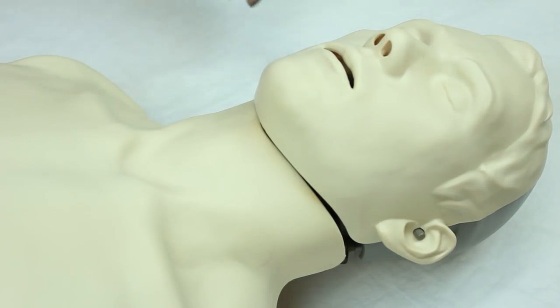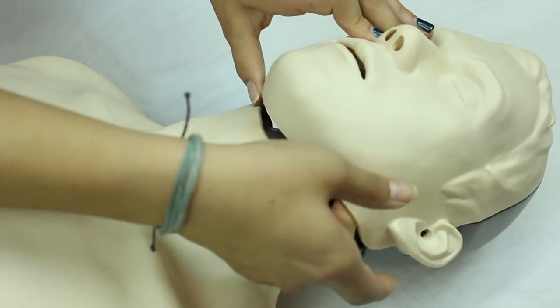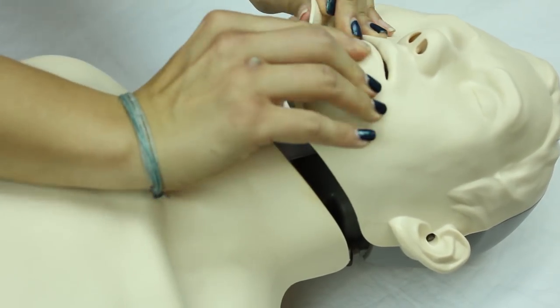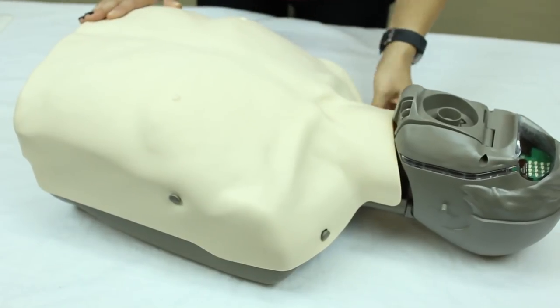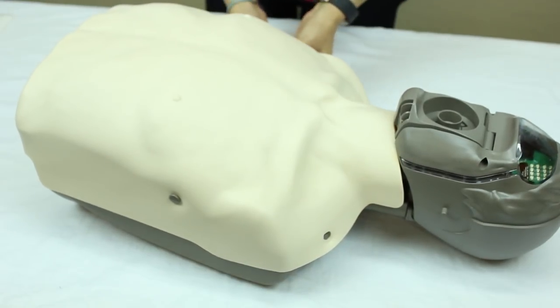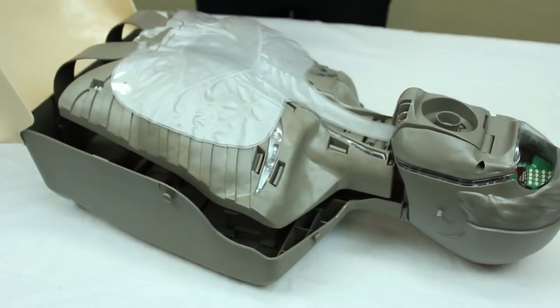To change the lung bag, first take off the face skin by unlatching it on the knobs and pulling it up. Then take off the chest skin by pulling it over the knobs located on the shoulders and on the side of the ribcage and peeling it back.